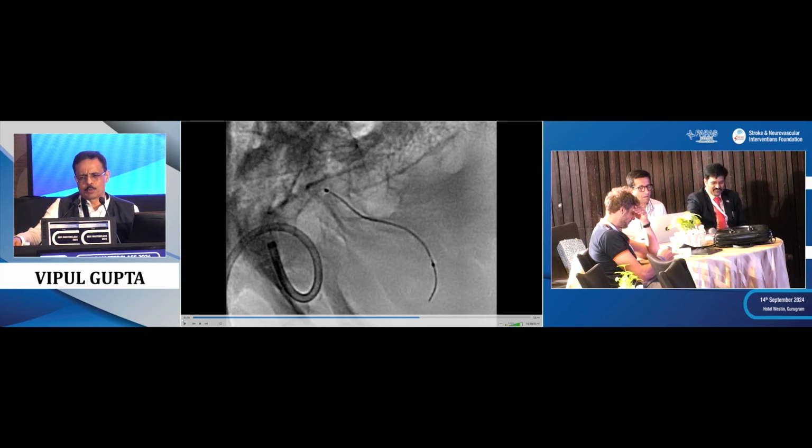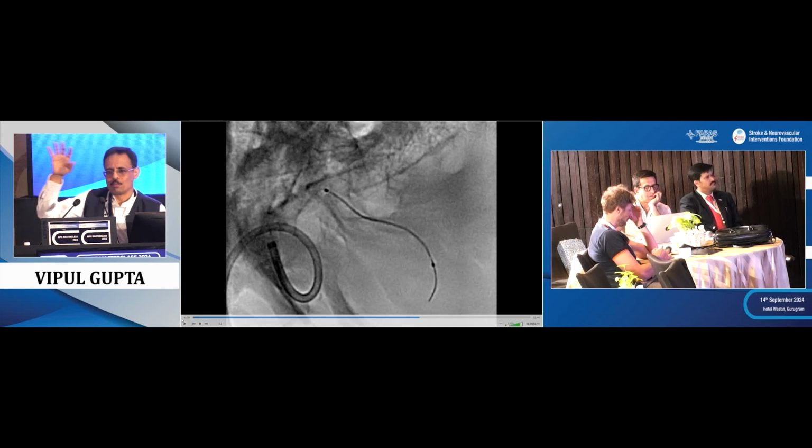And if this was a smaller PICA, as I said, in a flow diverter session, you are showing a couple of PICA cases, 90% of distal PICA we occlude. Only when we see a very huge PICA at times, and like the first case, proximal ones, we think about reconstruction. Maybe I've done only 3 acute PICA cases of reconstruction, 2 of them I'm showing here. The rest we have all done PVO. PVO is great. Even if there's small ischemia, they all recover very well. So let's not take away PVO as a first option.